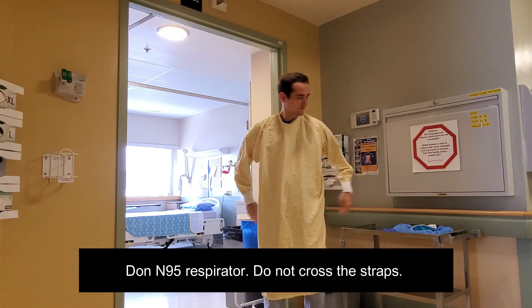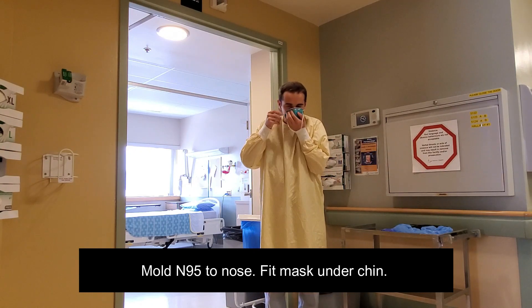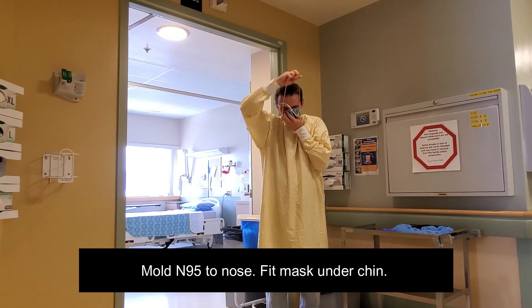Don the N95 respirator. Do not cross the straps. Mold the N95 respirator to your nose, ensuring that it fits under the chin.